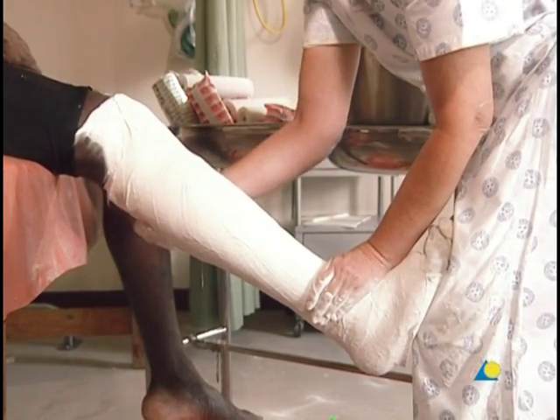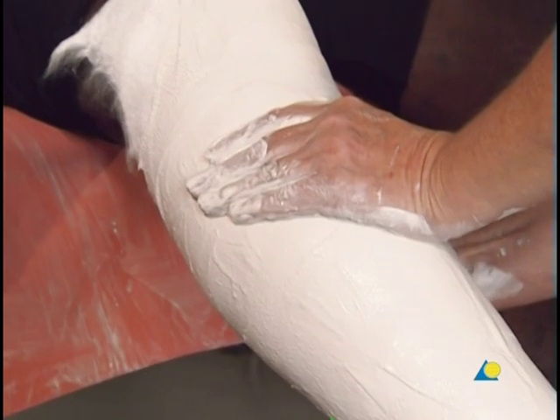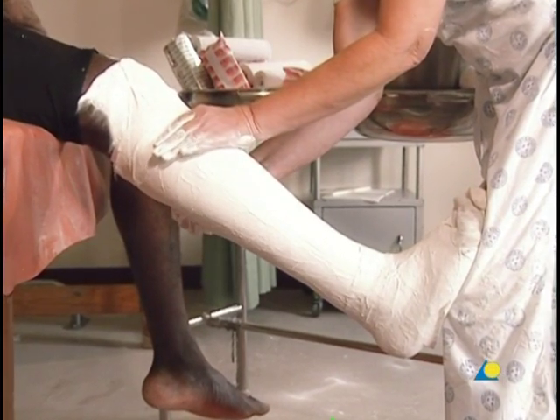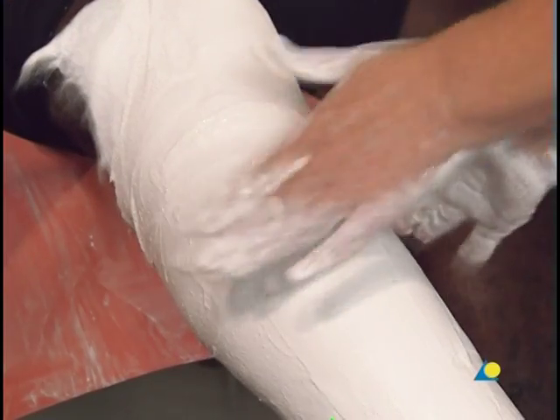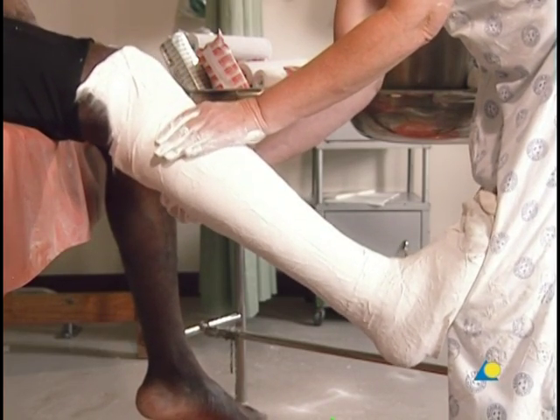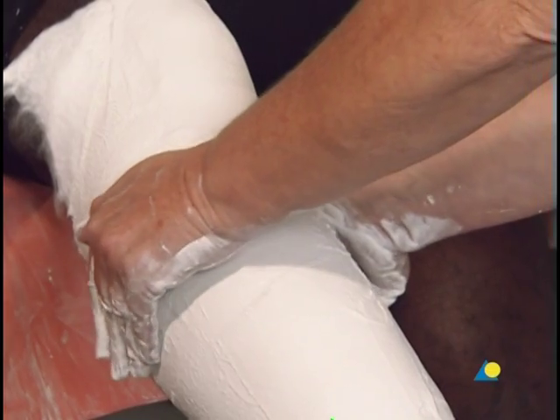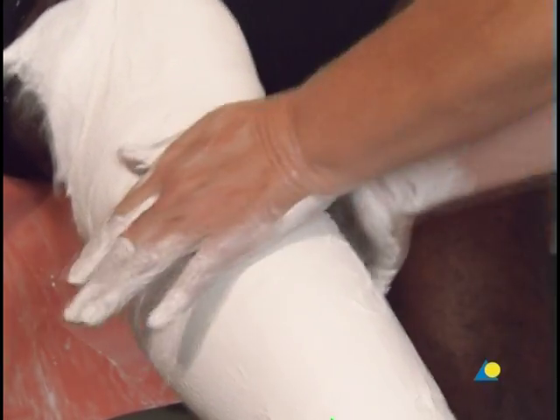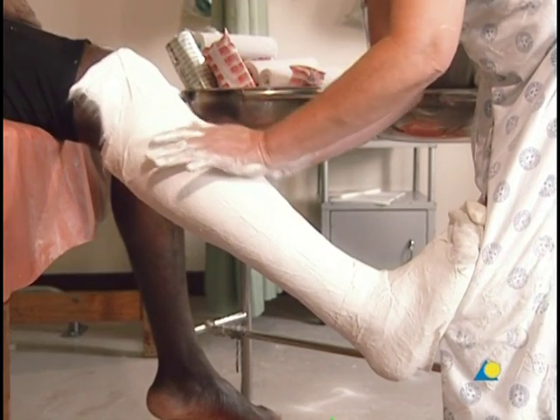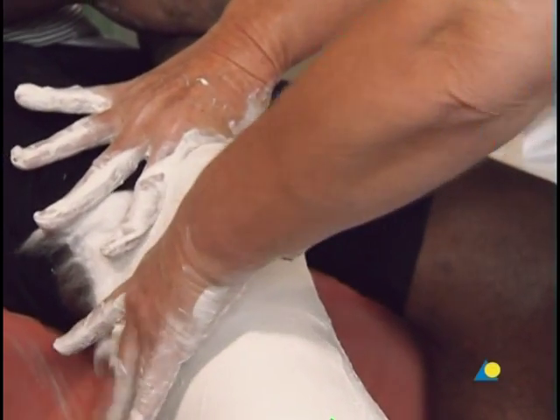Molding begins with one hand applying strong pressure between the heads of the gastrocnemius muscle as shown. The other hand molds plaster around the wings of the tibia. The thumbs are then used to mold around the wings of the patella and the quadriceps implantation area. Downward pressure is applied to the top of the patella with the thumb and forefinger, while the bottom of the patella is supported with the other hand.